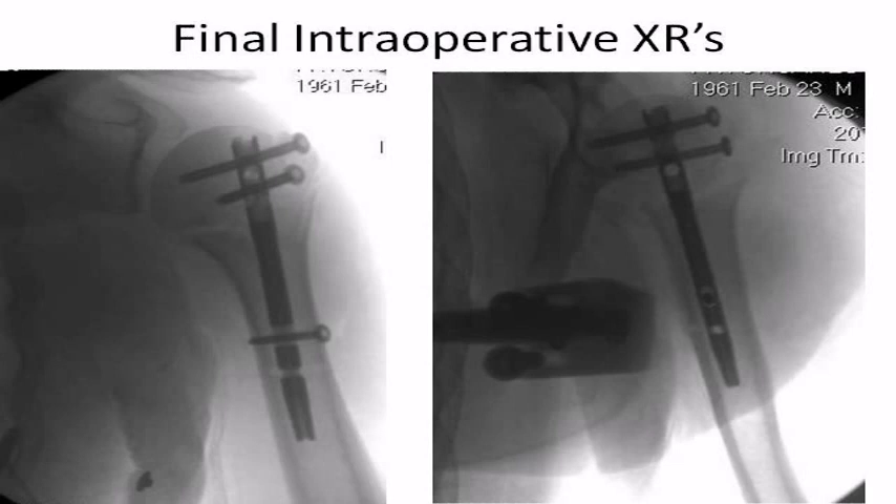The final intraoperative radiographs are shown. Because the nail was internally rotated somewhat, the position of the anteroposterior screw was not ideal for placement into the lesser tuberosity. However, because the rotator cuff was intact and was not disrupted during fixation, the lesser tuberosity was noted to be near anatomically reduced and stable underneath the humeral head. A tension band suture can also be placed from the subscapularis to one of the greater tuberosity screws in cases such as this.